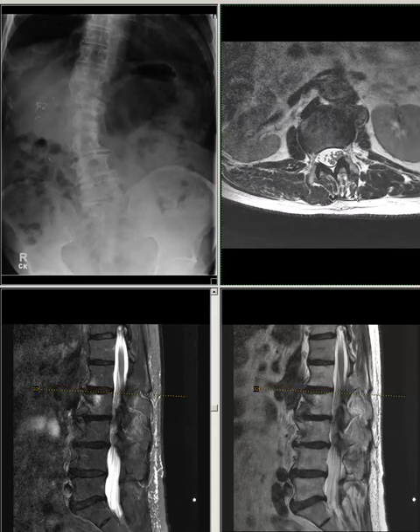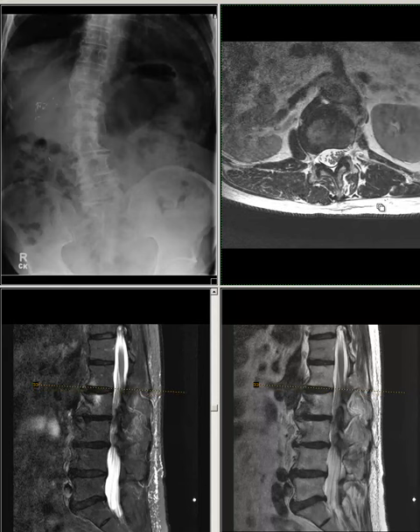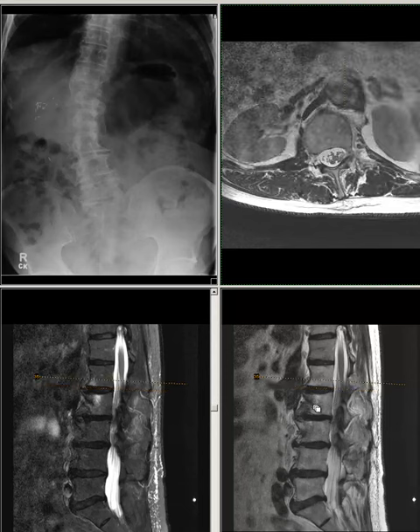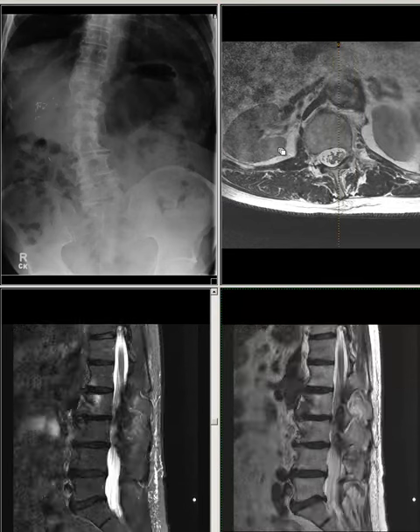At L1-L2, there is also a prominent disc-osteophyte complex protrusion anteriorly noted, without nerve compression. No evidence of spinal canal stenosis. Bilateral neuroforamina are patent.